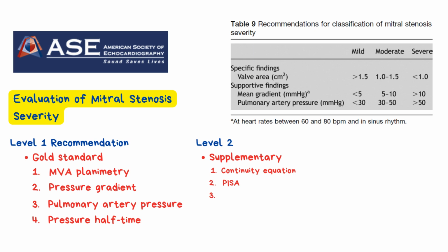And finally, stress echocardiography, which can be performed using either exercise or pharmacologic agents like dobutamine. This test evaluates how the valve behaves under stress. It's especially valuable in patients with exertional symptoms but normal resting gradients.